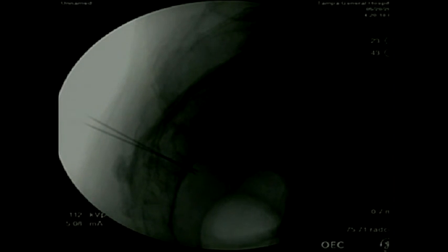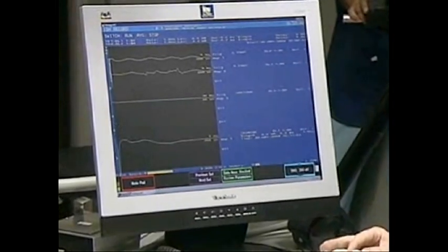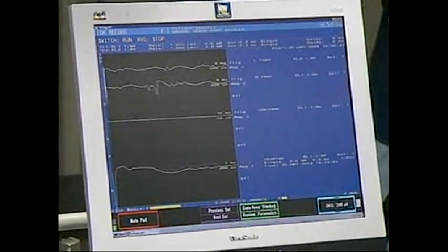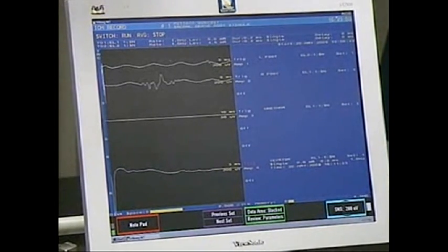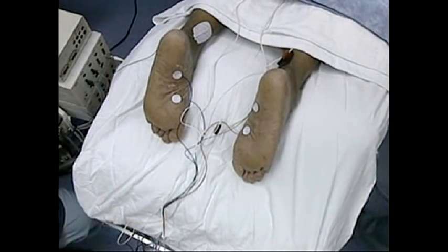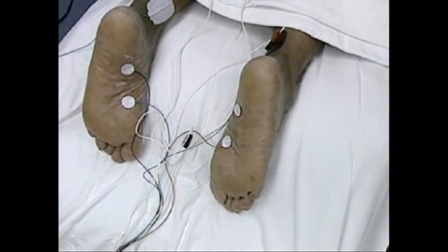That's a good one — that's what we consider the ideal response. What we're finding is that the actual amount of stimulus required for the patient's right side is four times more than what was required on the patient's left side. We are getting very minimal toe response and actually getting some rotation of his leg. If you look at his heel in the camera image, you can actually see the heel tilting inward as the leg rotates. What that's telling me is I'm getting an undesirable effect in terms of the amount of stimulation.